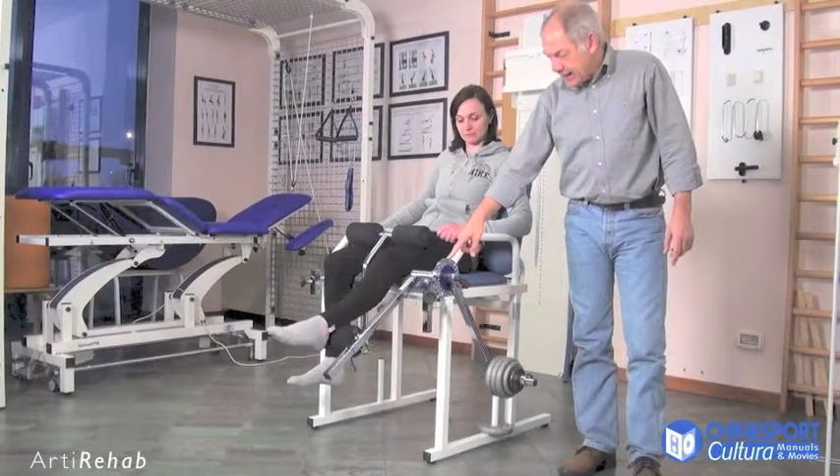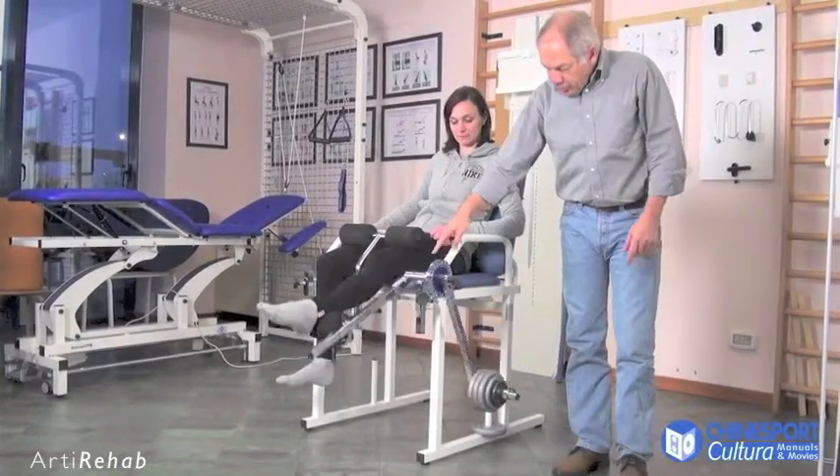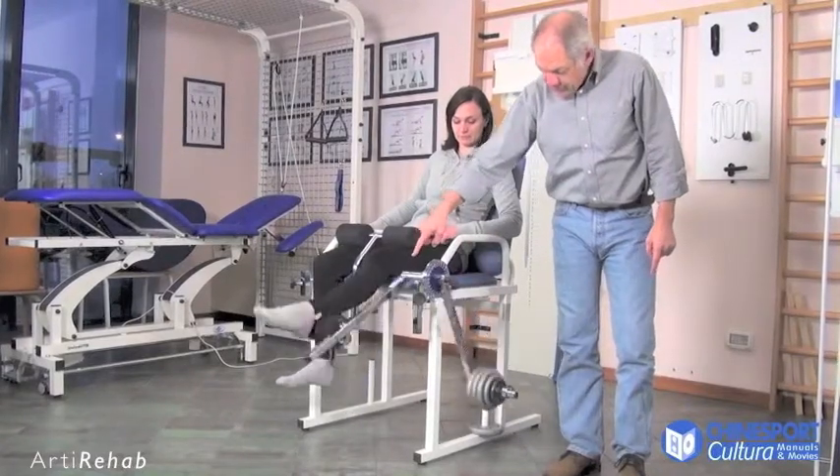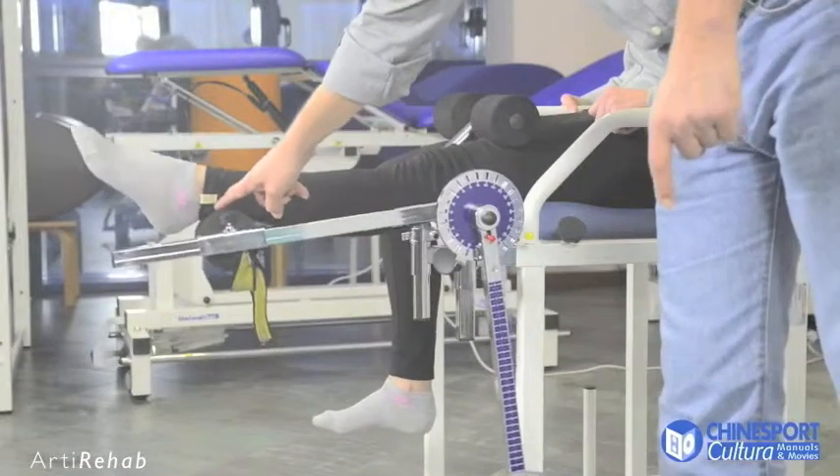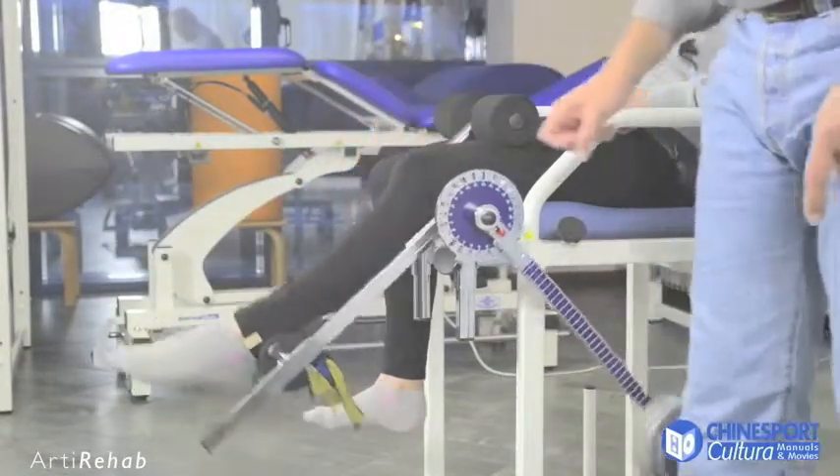In order to activate the rear thigh muscles, the loading arm must be counterposed to the thrust arm, so that the back of the ankle of the patient's foot rests on the cushion and the flexor muscle of the lower limb is activated.